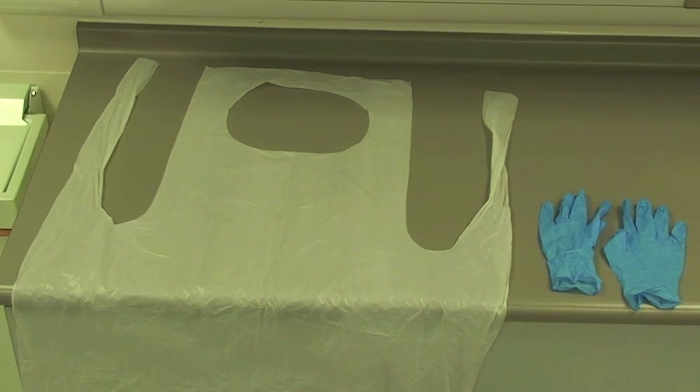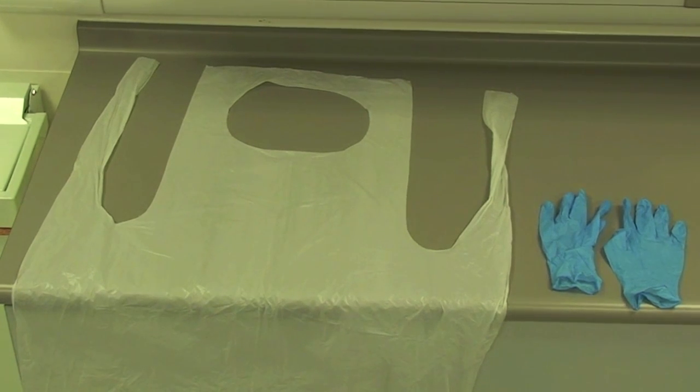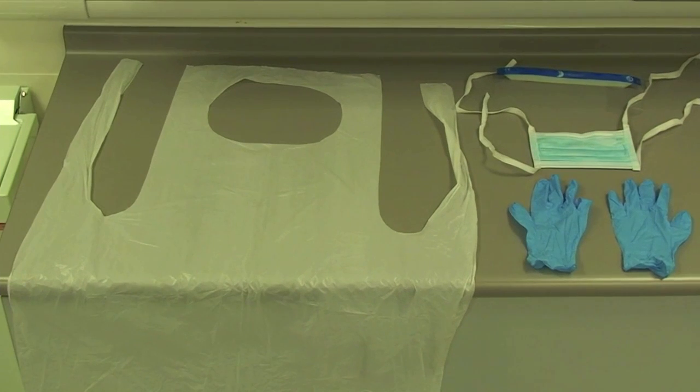The PPE which should be worn when dealing with a patient who is deemed as low possibility of Ebola is an apron and nitrile gloves, plus a mask and visor should there be a risk of splashing of blood or body fluids.